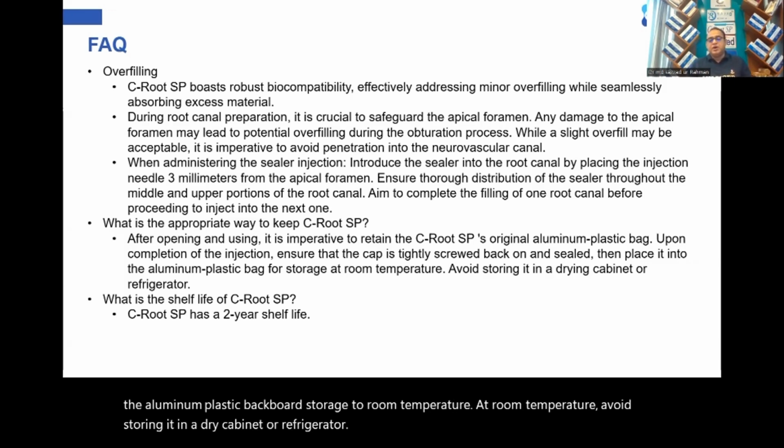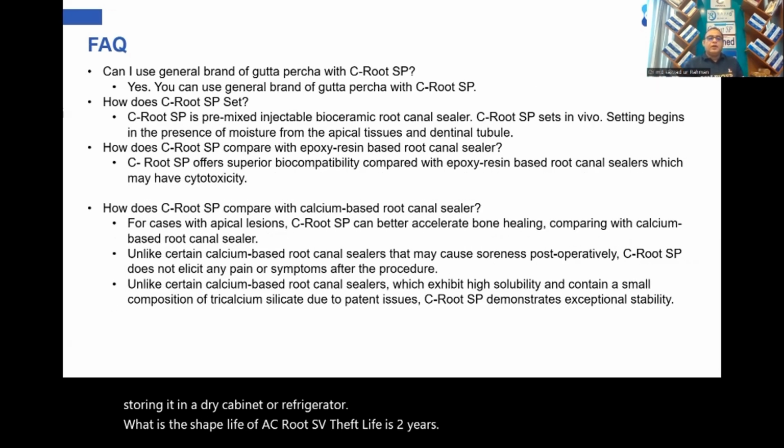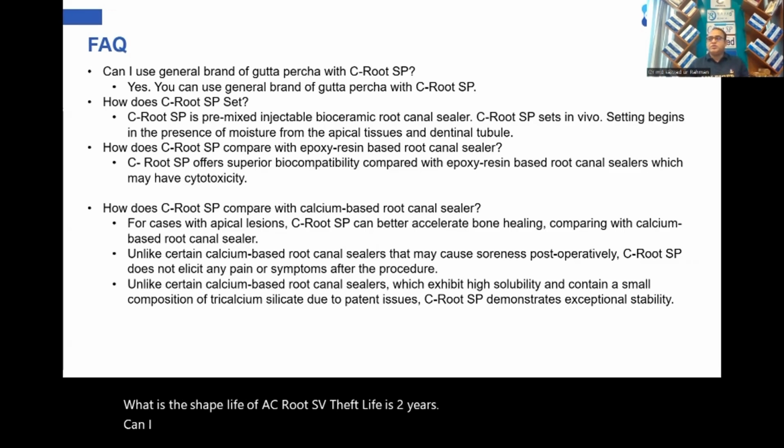What is the shelf life of C-root SP? The shelf life is 2 years. Can I use a general brand of Gutta Percha with C-root SP? Yes, you can use a general brand of Gutta Percha with C-root SP.